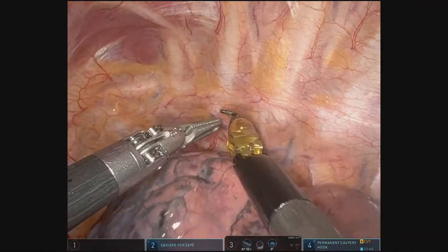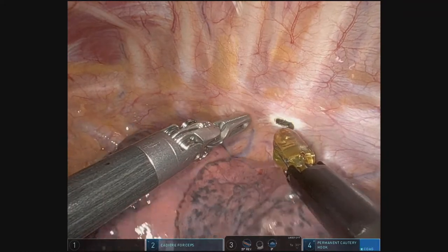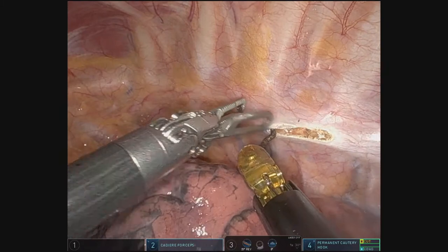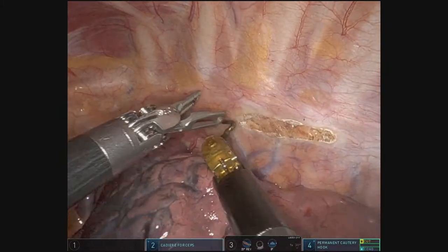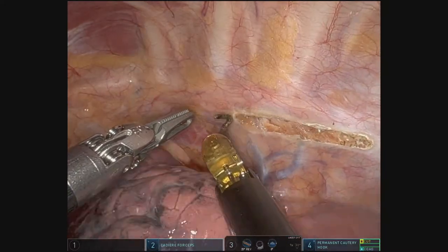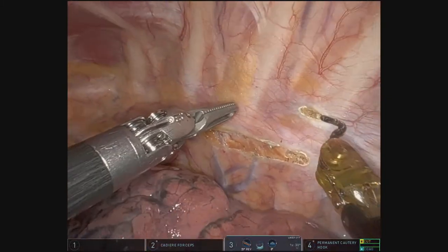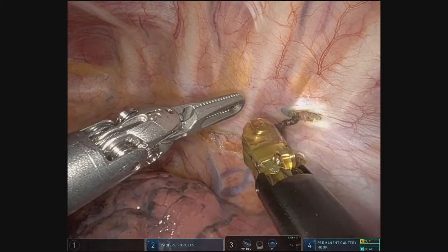This video will illustrate a bilateral sympathectomy in a 35-year-old female with palmar hyperhidrosis. We started this operation in the left chest, where the pleura just below the sympathetic chain — that long white structure — is incised. We'll also incise the pleura about two centimeters above the chain to incorporate any aberrant nerve bundle of Kuntz.